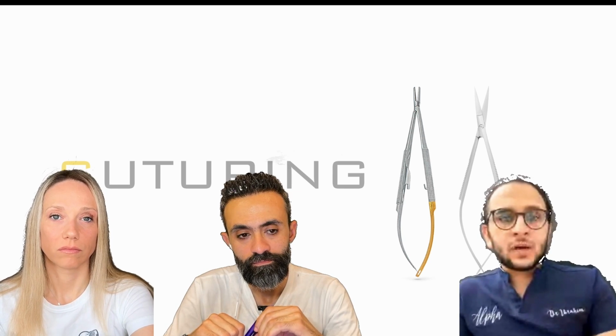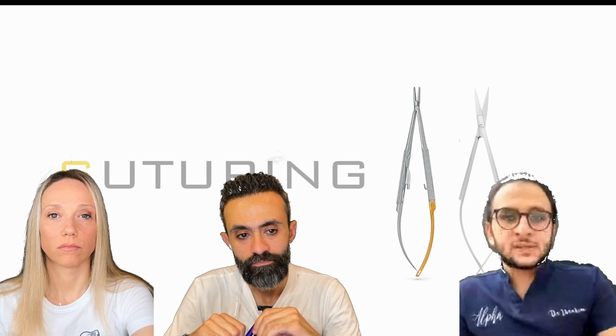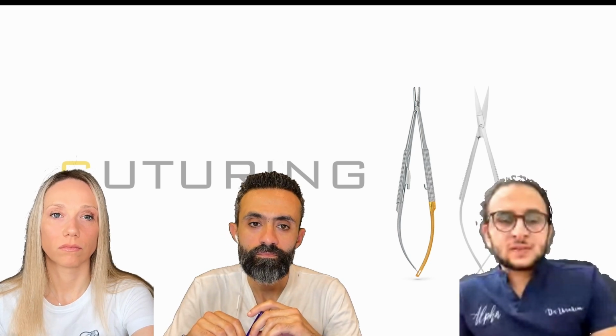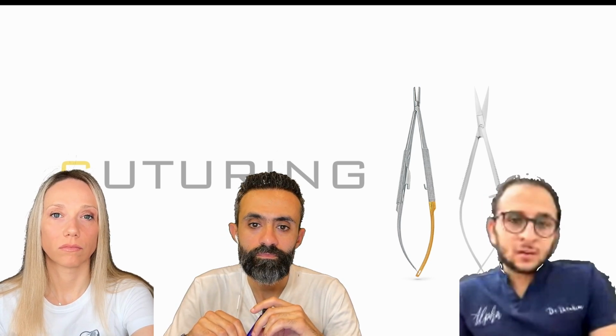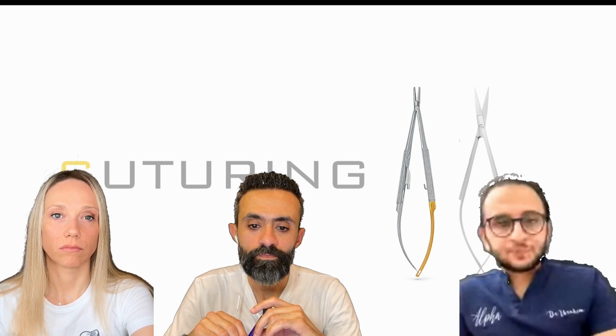For this purpose, we are using a Castroviejo and a micro scissor. This instrument, in my opinion, is a one-time purchase. They are expensive, but you're not going to buy them daily. So it's better to get a good brand other than buying a normal brand and throwing it away daily.